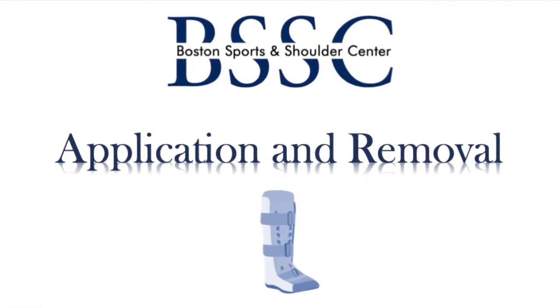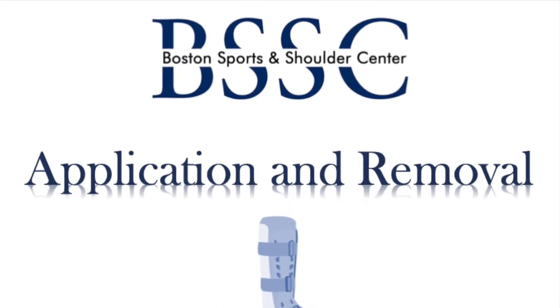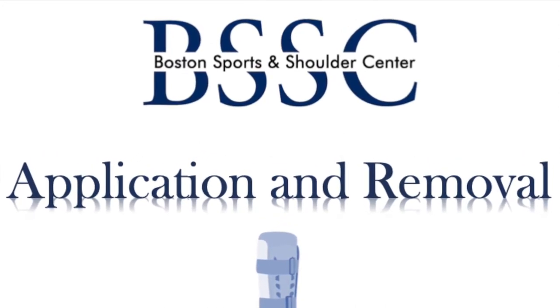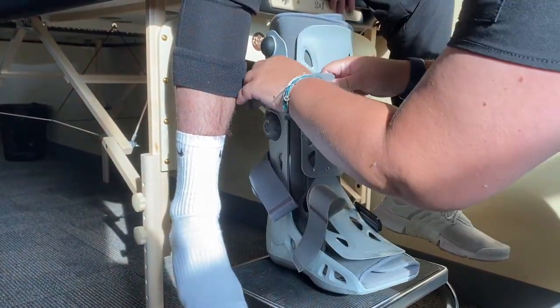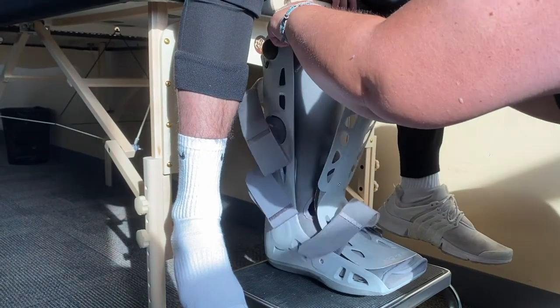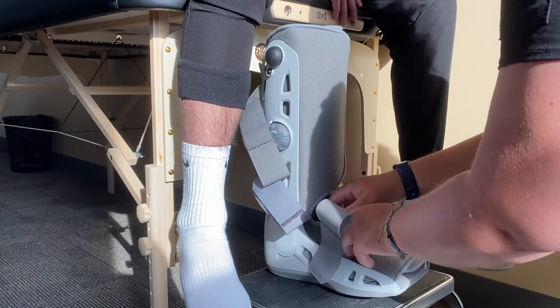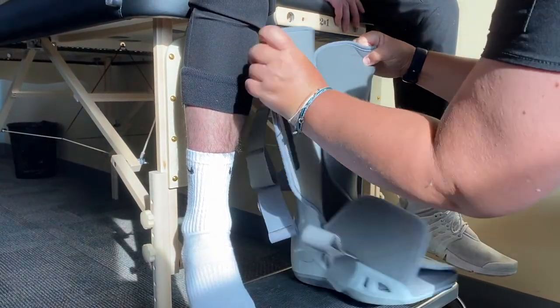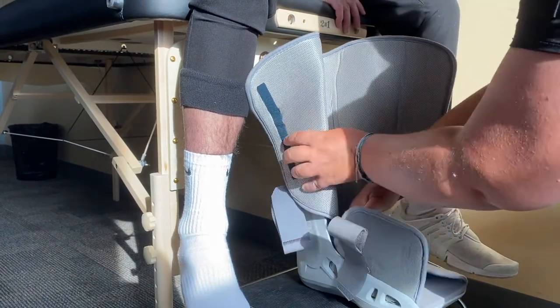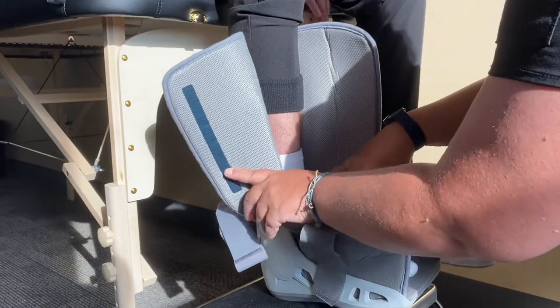The AirCast AirSelect walking boot sizing is dependent on your typical shoe size and will be appropriately determined for you at your initial fitting. To apply your boot, first unfasten all straps and remove the protective front panel. Next, place your foot flat into the boot liner. Please ensure your heel is positioned as far back in the boot as possible. Proper sizing and fit ensures your toes will fit comfortably along the bottom of the boot and are not hanging over the edge.